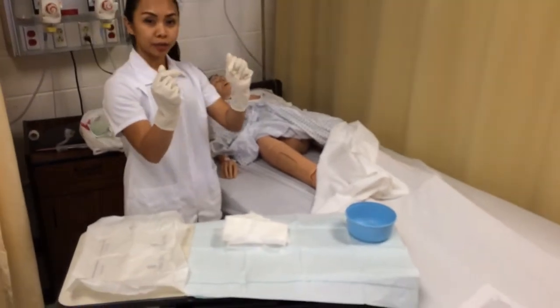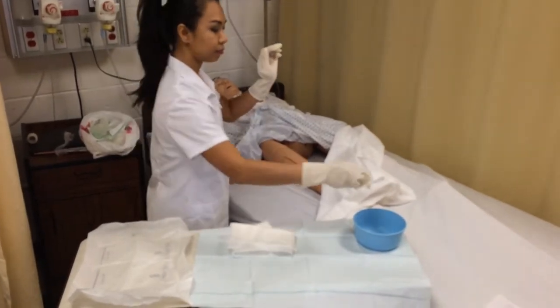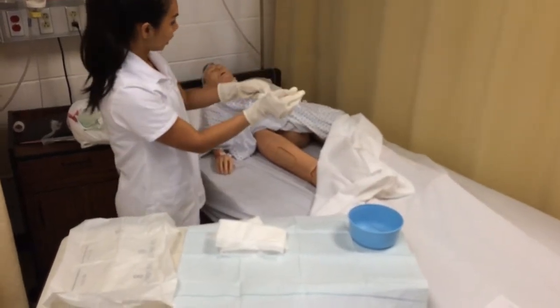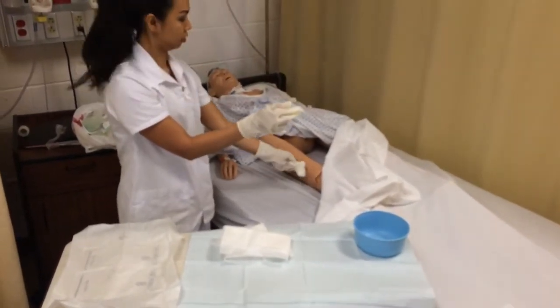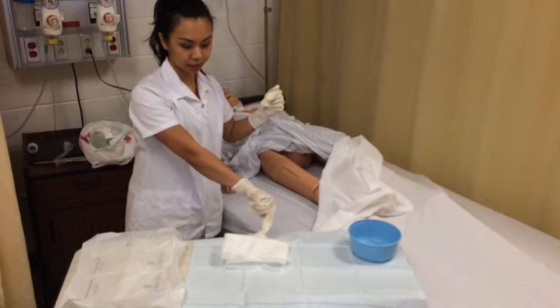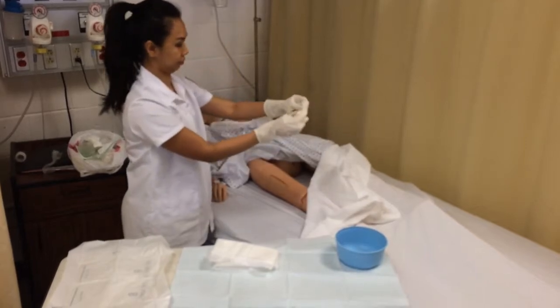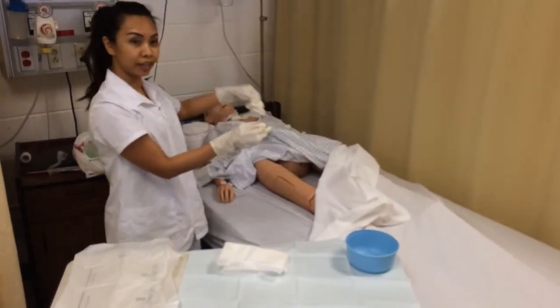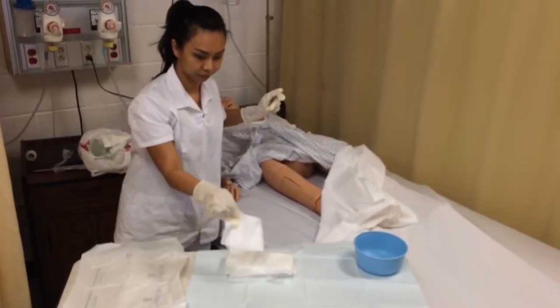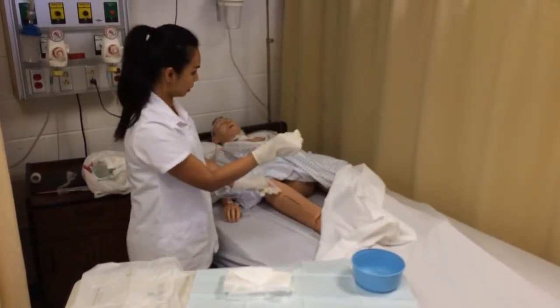Now I am going to clean the wound first. I dip the gauze into the saline, then clean from the center outward. Then I clean on the sides, one stroke at a time in one direction, then the other side.